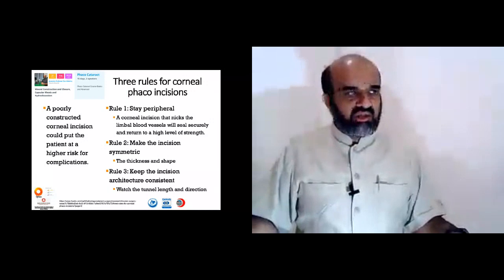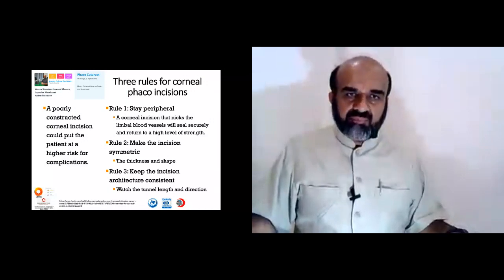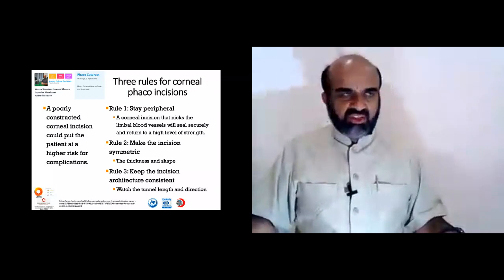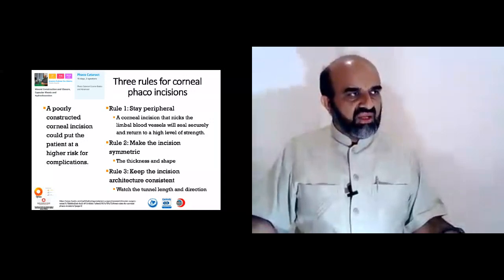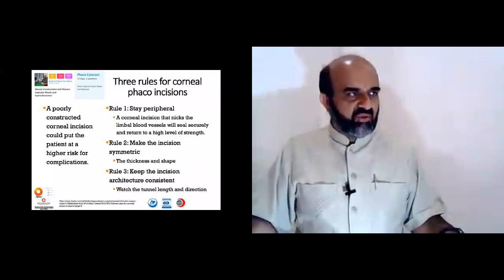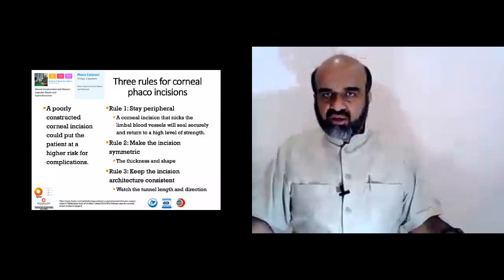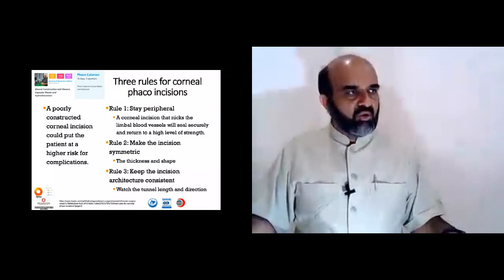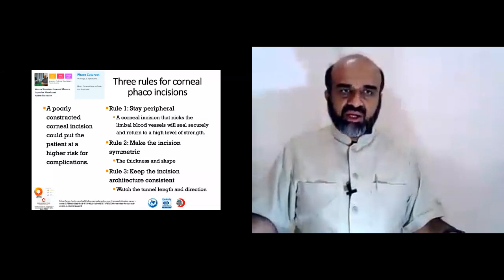But the main passage through the corneal stroma should not be directed parallel to the iris, it should be directed towards the apex of the cornea. That will make the roof and floor of the incision equal in depth. Shape of the incision: as we know, the incisions which are parallel to the limbus induce more astigmatism. The straight incisions induce less astigmatism, and the frowning incisions induce even less astigmatism. So the general preference would be, because we use keratomes, that we place the keratome in proper position and keep a good direction throughout the incision and keep the eye stable, and the angle of entry into the corneal stroma is very important.